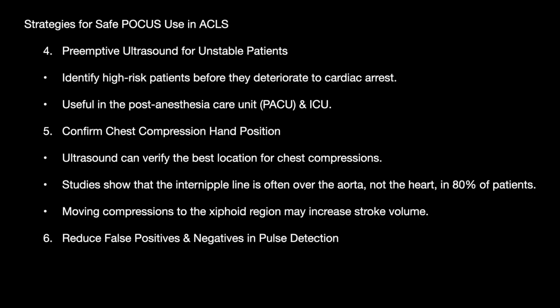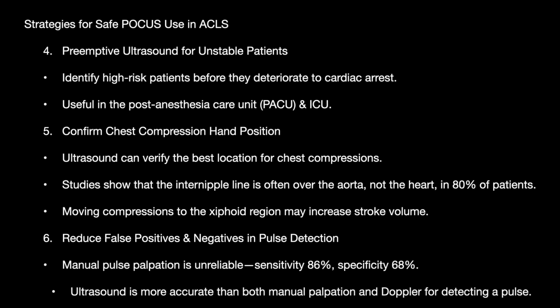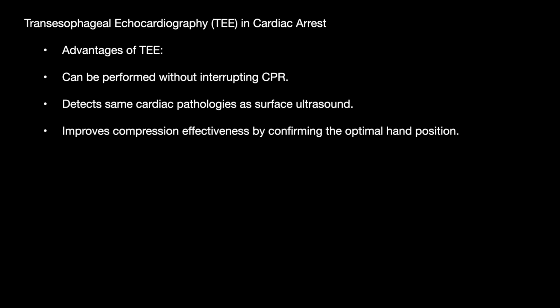It can reduce false positives and negatives in pulse detection. Manual pulse palpation is unreliable, with specificity as low as 70%. Ultrasound is more accurate in these cases. TEE can also be used. The advantage is that it can be performed without interrupting the CPR, and it detects cardiac pathologies as surface ultrasound does. It improves compression effectiveness by confirming the optimal hand position.